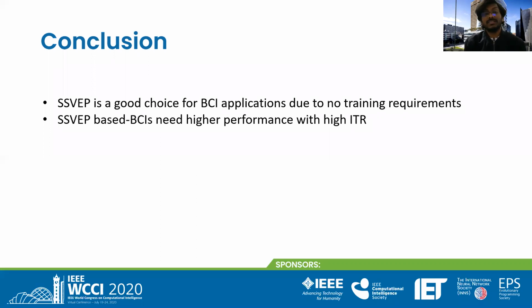So we need this system to have high performance and, more importantly, a higher information transfer rate. It needs to make users feel more comfortable to interact. I'm talking in terms of a real-time system, but of course offline you can do a lot more things. But once you develop the algorithm offline, only then can we use it online in real time.